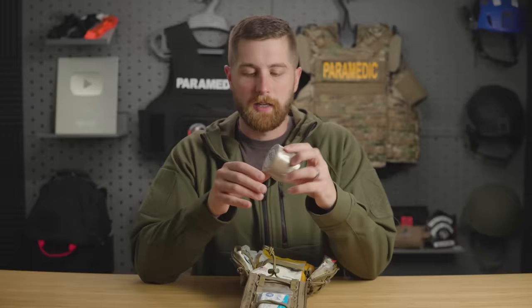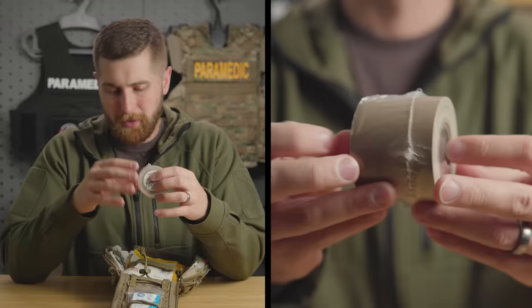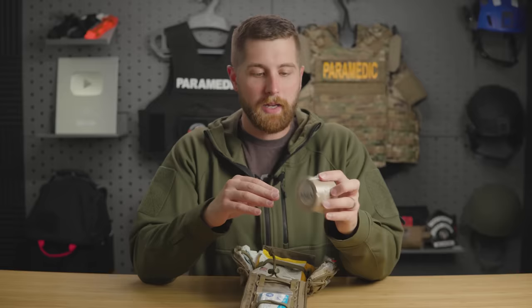At the bottom, you saw me take it out. This is Gecko grip tape. It's just really heavy duty tape. The uses for this are endless. Now, most of them are medical, but you can use this to repair gear, or do any number of things. So I like having some tape in here.